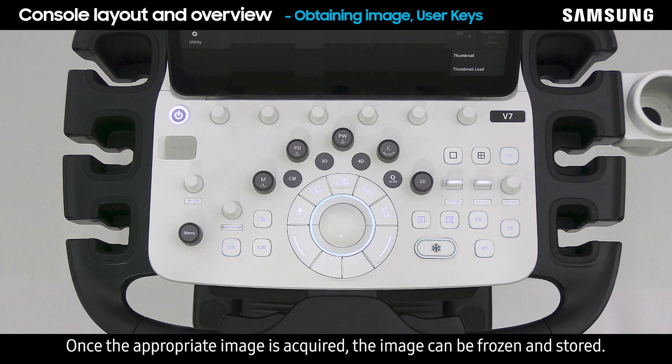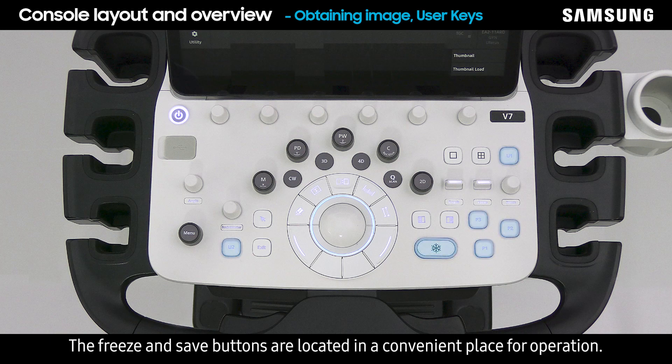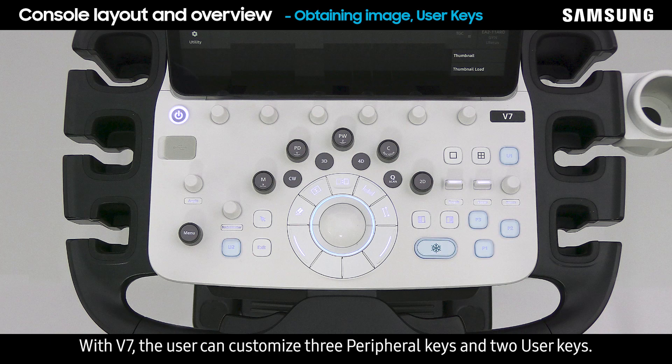Once the appropriate image is acquired, the image can be frozen and stored. The freeze and save buttons are located in a convenient place for operation. With V7, the user can customize three peripheral keys and two user keys.